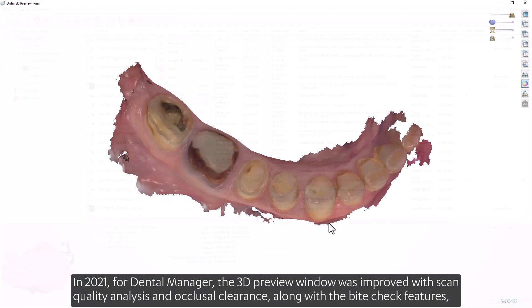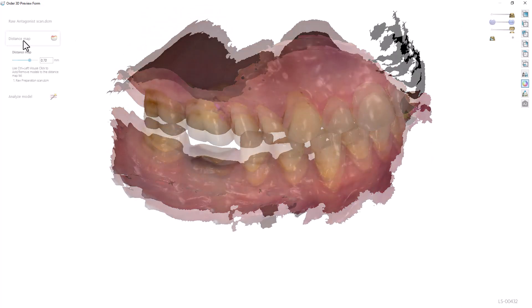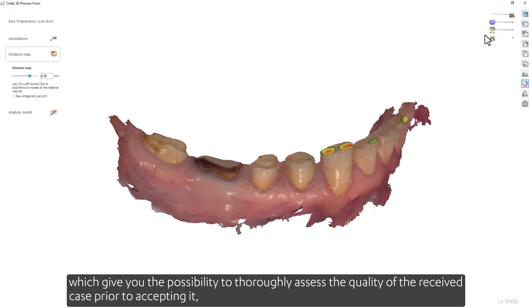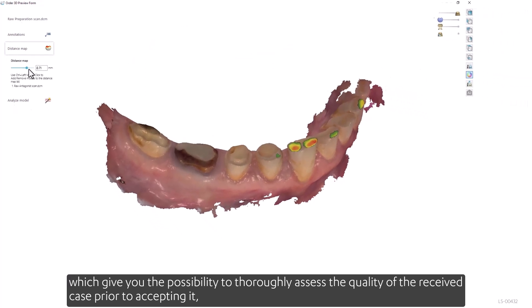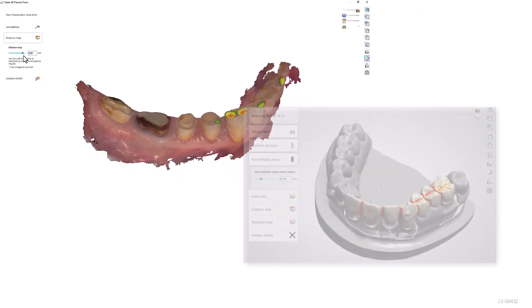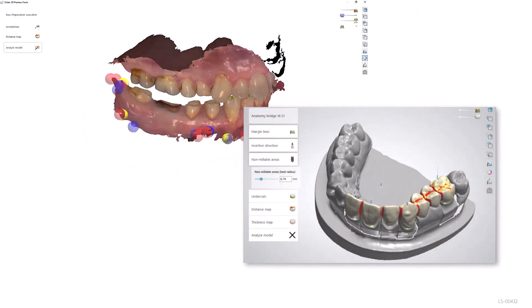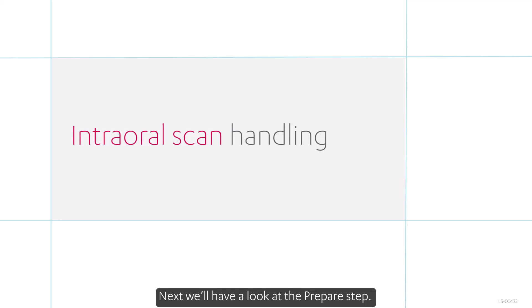In 2021, for Dental Manager, the 3D preview window was improved with a scan quality analysis and occlusal clearance along with bite check features. This gives you the possibility to thoroughly assess the quality of a received case prior to accepting it, or to validate the quality of the designed restoration.